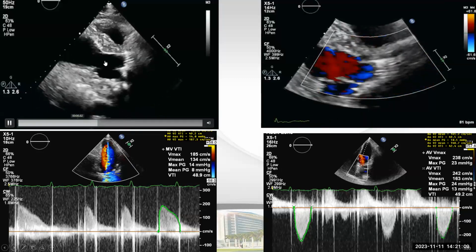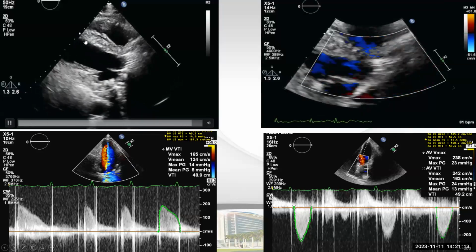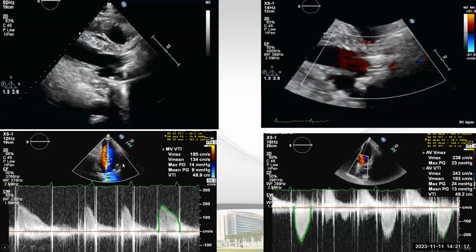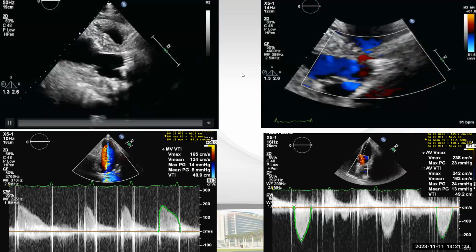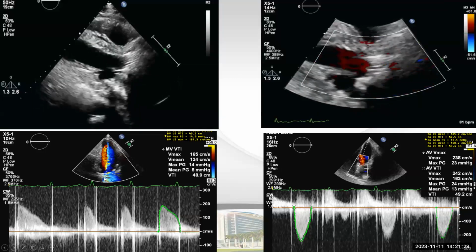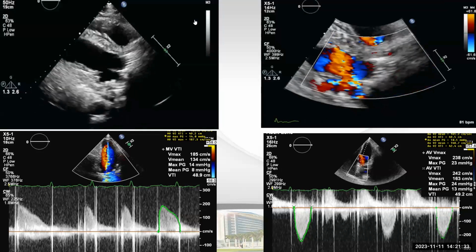Somebody said paradoxical septal motion. That's right, because of the post-operative state. You may also have some wall motion abnormality in the posterior wall, but this is not the question. Now, is it enough to answer mechanical valve, TAVI, normal function? There is LVH. Normal function of both of these valves or only one? Normal function. Okay, so the mechanical mitral valve is functioning normally.